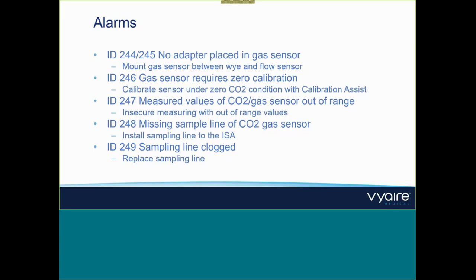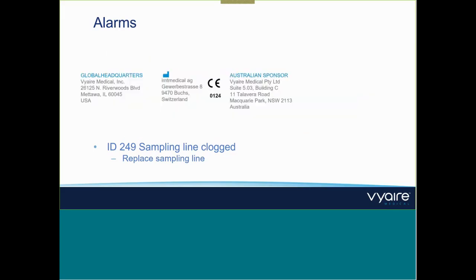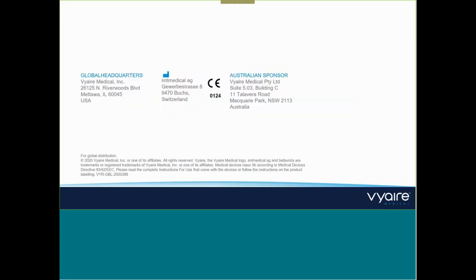Another question from Subnil is, what is the shelf life for the adapter and sampling lines? And when we need to change the accessories used on patient, means what is the recommended time frame for one sample line and adapter? That's a good question. I have to pass on the shelf life. I think it's 3 years, but I'm not 100% sure. I have to take a look on this.